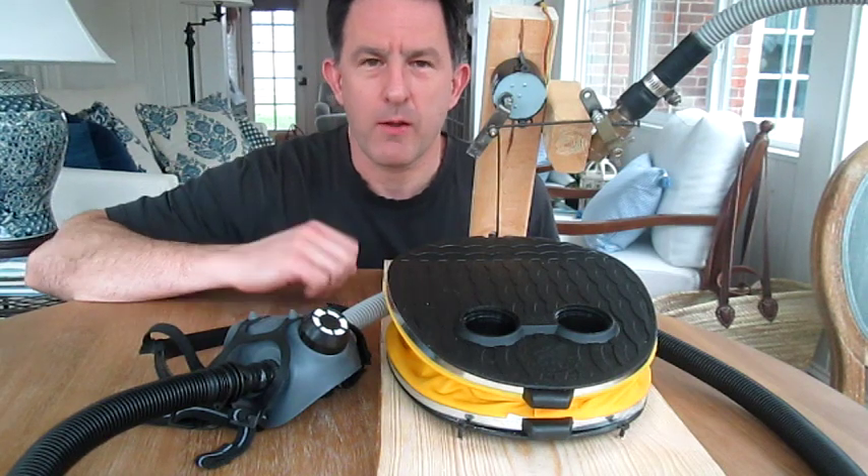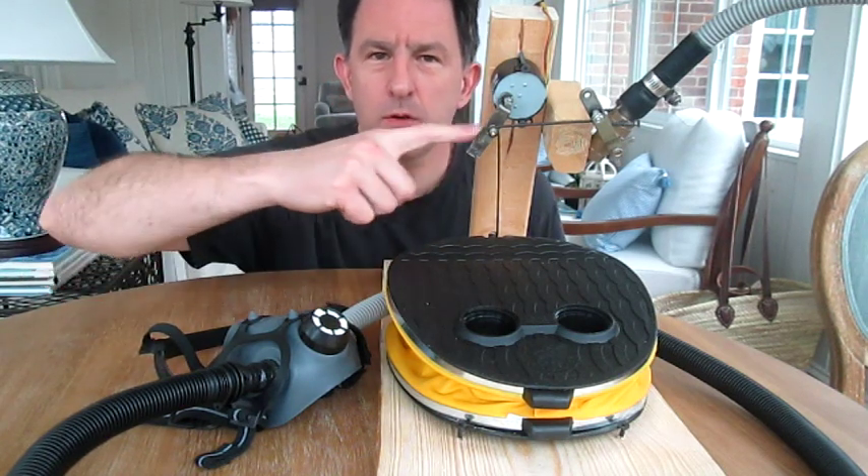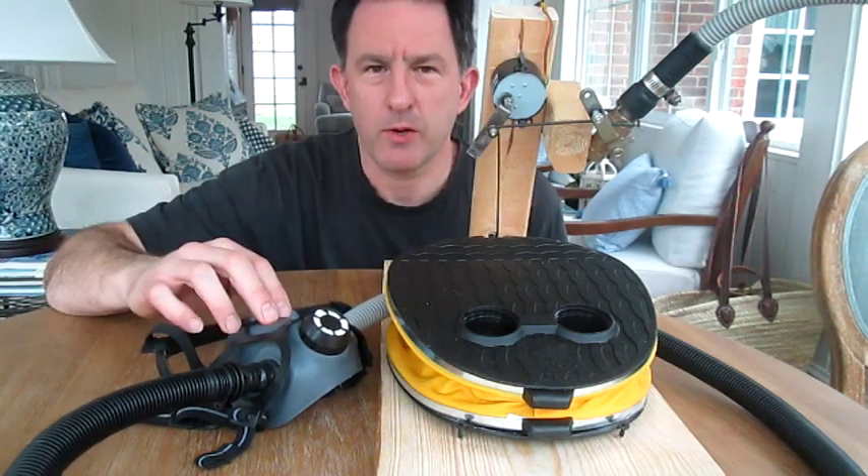Hi, I'm Lou and today I'm going to show you how I built this ventilator using a motor, a bellows pump, and a respirator mask.